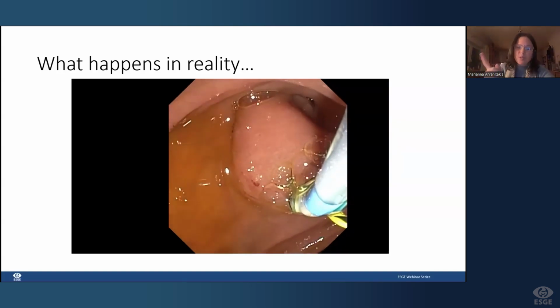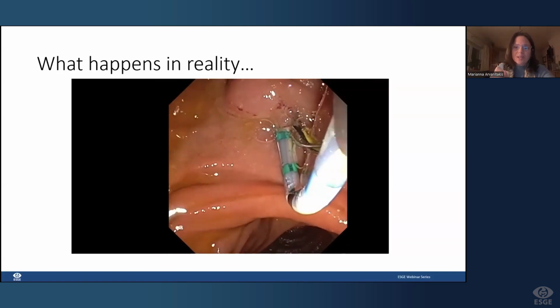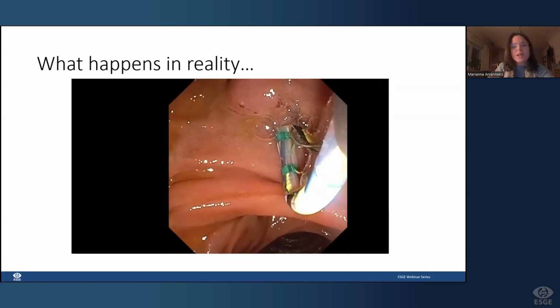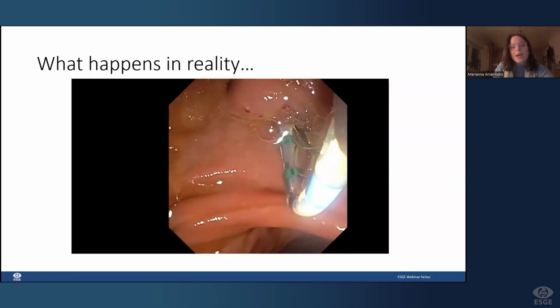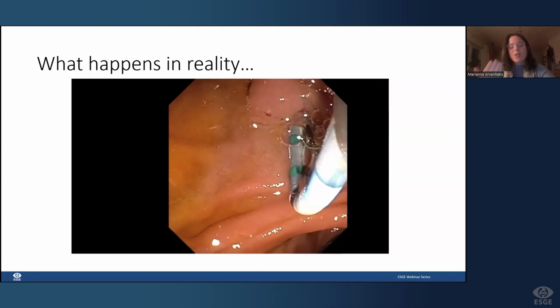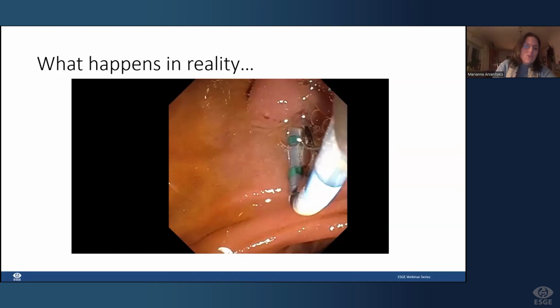I think George will talk about the siphon, a word we don't like to hear, but this is an anatomy that is not straight. It will straighten a bit. We'll give it another bit of a bend, and we'll try trial and error with the guide wire, a second guide wire, to get into the bile duct this time. The fact that the guide wire is occluding in the pancreatic duct also helps us to have more chances of getting into the bile duct this time.